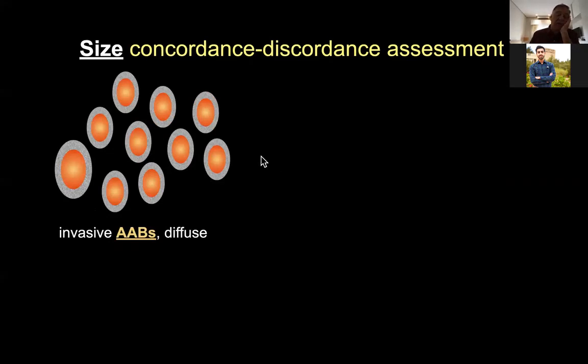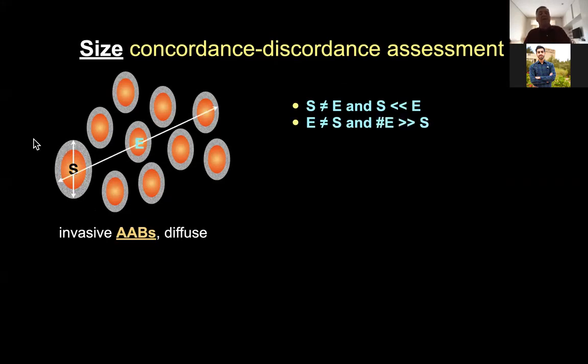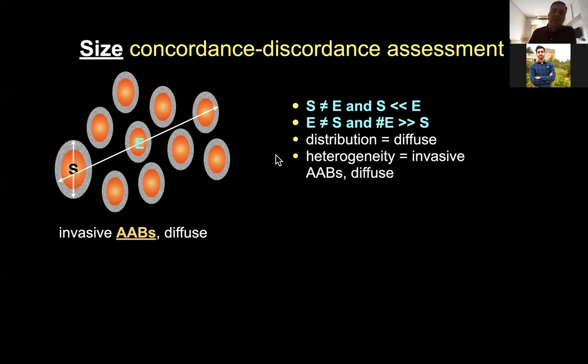If we have diffuse disease with multiple small invasive lesions, like we often see with invasive lobular cancer, then there can be a huge difference because according to TNM, the size of the lesion is the maximum diameter of the largest of the multi or diffuse invasive lesions, but the outside to outside dimension is going to be more pertinent in terms of the prognosis and treatment.